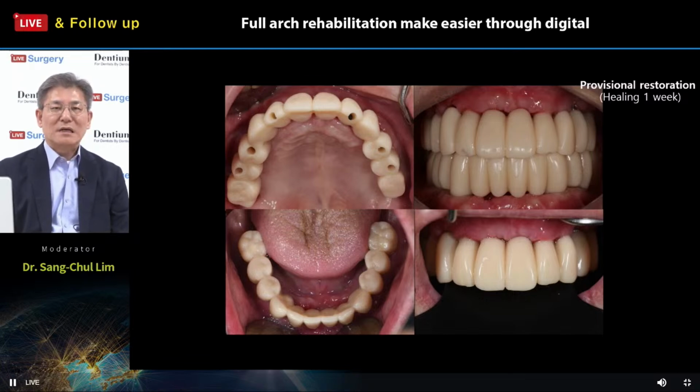Actually, as I mentioned before, all the implant fixtures get higher initial stability from proper, good positioning and a good installation procedure. So this immediate implantation and immediate prosthesis will be done, with the provisional restoration delivered one week after surgery. Okay, so the whole procedure is wonderful and perfect and beautiful. So I am very happy, and actually, the patient was happy too.